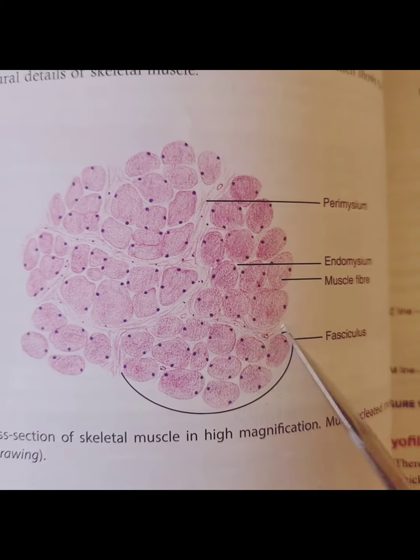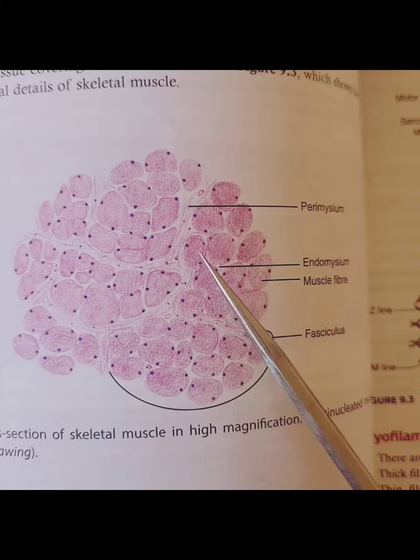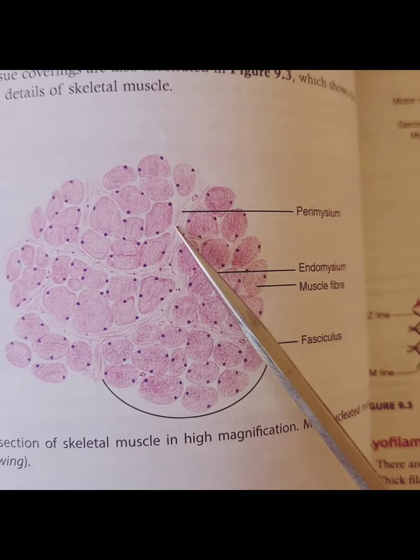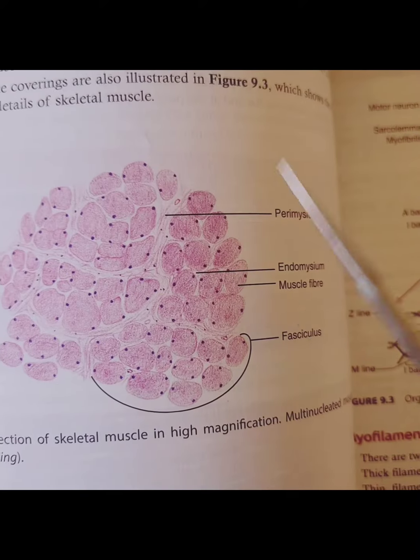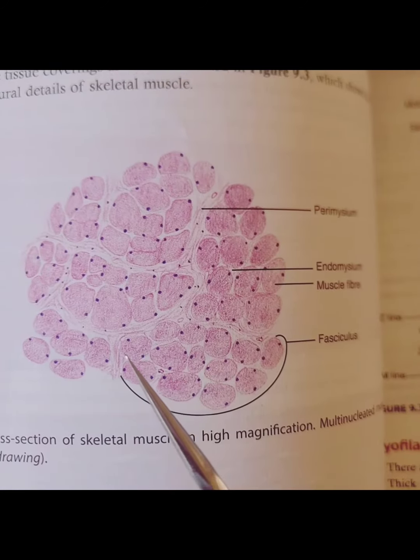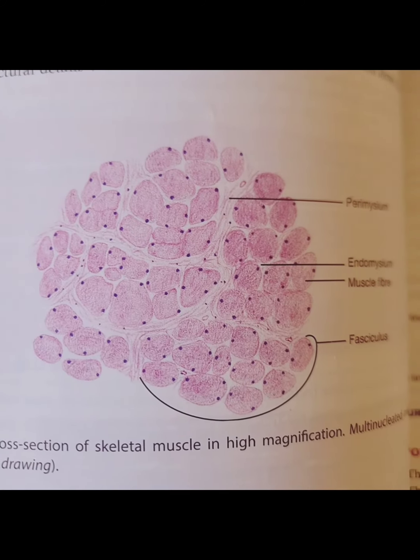So this is the boundary for every fascicle, and fascicle is covered by perimysium, and every muscle fiber is covered by endomysium, and whole of the muscle belly will be covered by epimysium. In the transverse section, we see nuclei which are peripherally located within the muscle fiber.